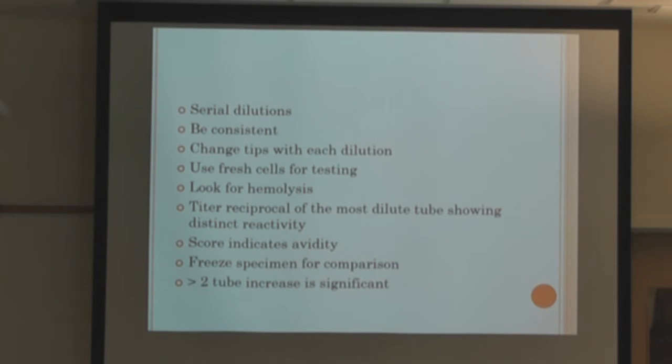And so wherever you work, in their SOP, they will say you will use a homozygous expression if possible, or you will use a heterozygous expression. And whichever one they dictate that you use is what you should really use. My personal philosophy is the baby's only going to be affected for a heterozygous cell, and that's what you really need to do your titer. However, I thoroughly understand why you might want to use a homozygous cell and get stronger, cleaner reactions. As long as you always use a homozygous cell, there's no problem.